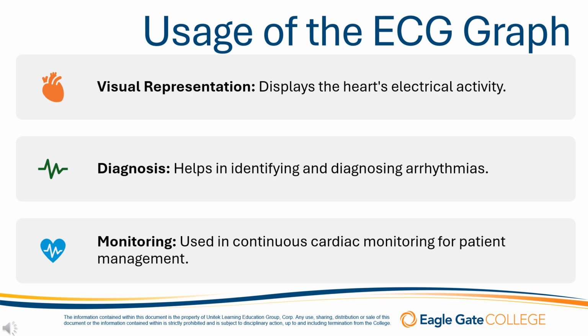Telemetry involves remote monitoring of the ECG. Patients can be monitored continuously while being mobile within the hospital or even at home. Telemetry units send ECG data to a central monitoring station where healthcare professionals can review and respond to any abnormalities.